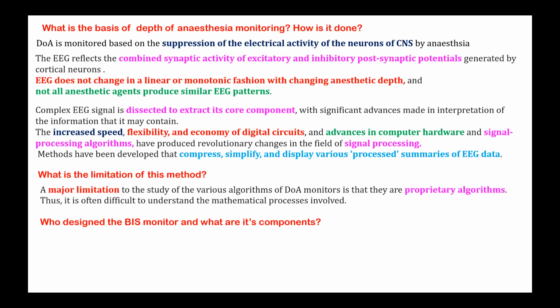Four electrodes are placed on the forehead, sir. Very good. And why four electrodes? What is the function of those four electrodes? To look at the burst suppression ratio. Burst suppression ratio, okay. Do they monitor only the electrical activity of the brain, or does it monitor something else also? Muscle activity, electromuscle. The frontalis muscle activity is also measured.